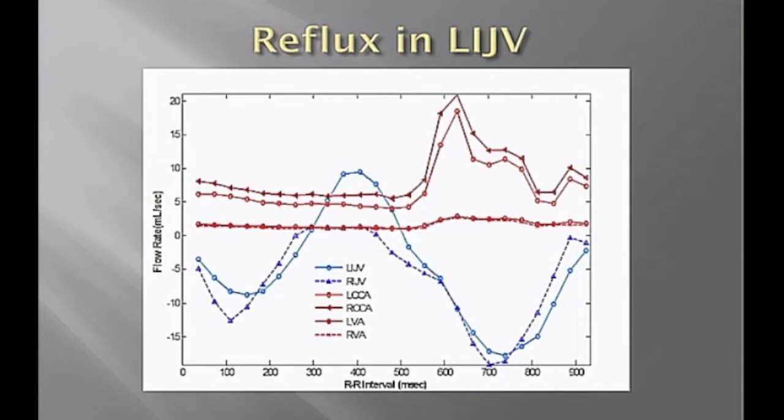But there are times that we will see what we've called the circulatory flow, where in fact we won't see the integrated venous flow ever going to zero. But if you carefully evaluate the data and look at the positive and negative components of a given jugular vein, you can find that there are times when there is, in fact, a negative component. And you will only see that if you analyze the data for both positive and negative components, because when you integrate over the whole vessel, you may not see it.